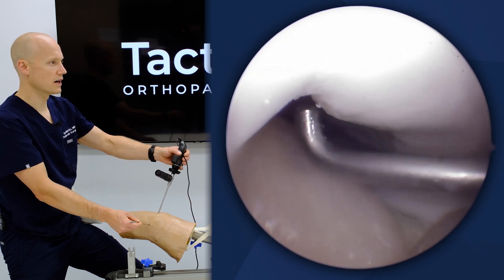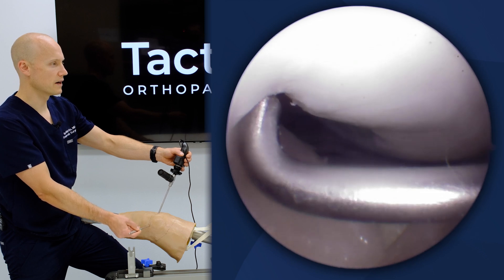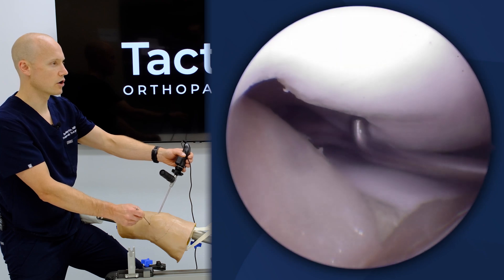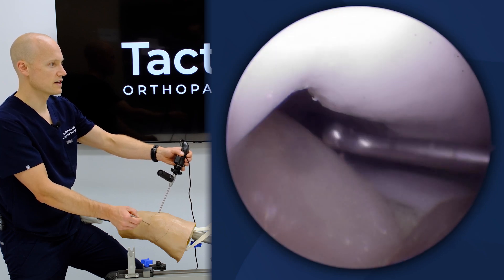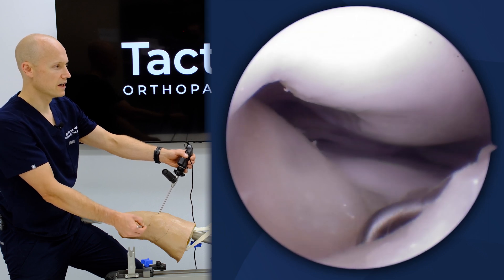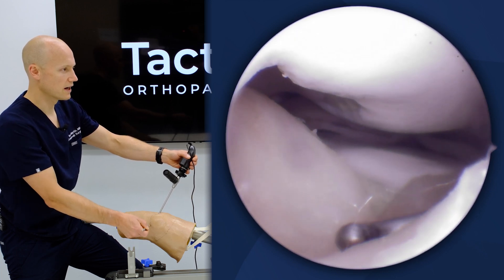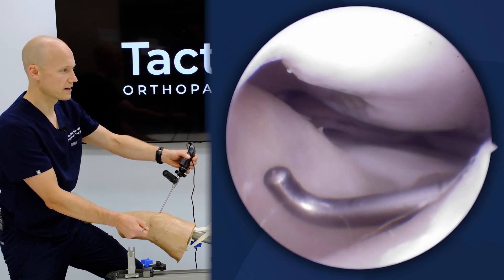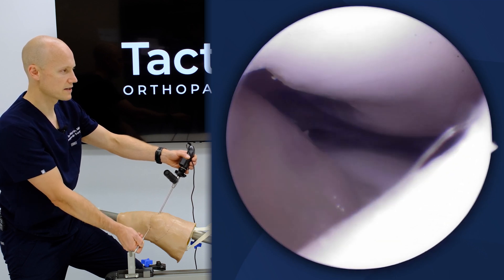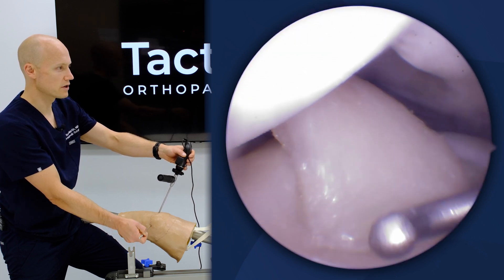In the intercondylar notch, we have the notch of Grant or the apex of the trochlear notch, the transition to the mid-arch points, and our ACL which is competent. We have the fat pad, which I'm going to try to move and retract out of the way, and then I can show you the intra-meniscal ligament that tracks just in front of the meniscus, which some people use as a reference point for the ACL reconstruction.